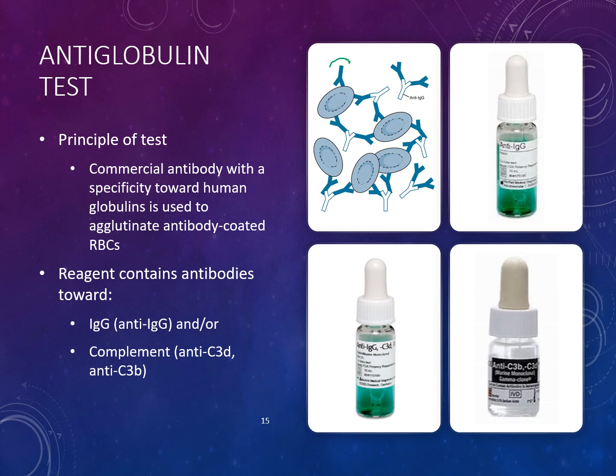You have all these antibodies attached to this red cell, and then you come in behind that and add some anti-IgG or anti-human globulin that will attach to those IgG antibodies. We don't necessarily know which particular IgG antibody, we just know that there's one attached. So we're looking to see if there's something attached.